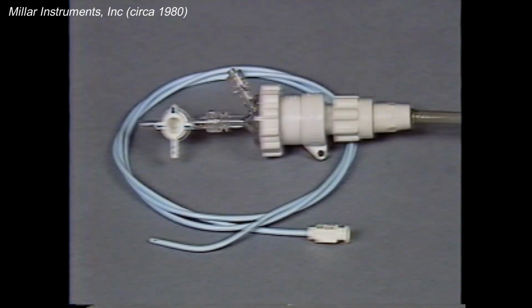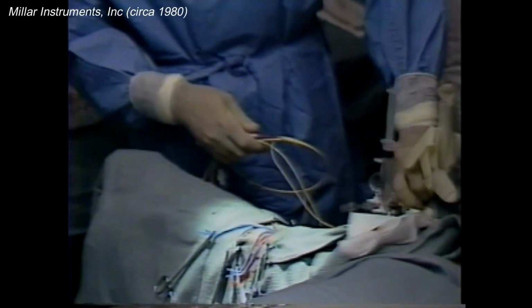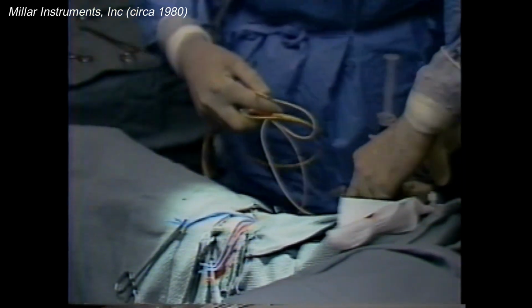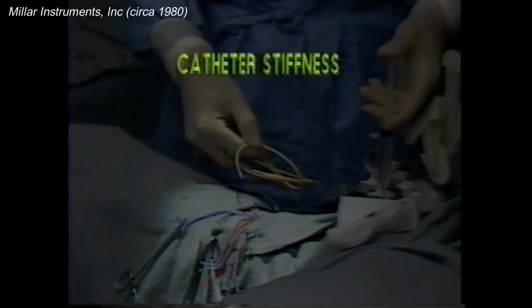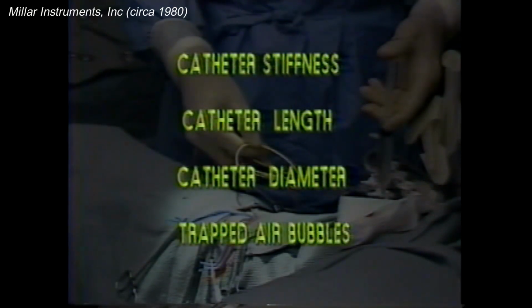Therefore, to understand this difference, we should first review those factors which affect fluid-filled catheters and their frequency response. The fluid in the catheter, because of its length and weight, limits the frequency response of the external transducer system. Four major interrelated factors that control the amount of distortion are catheter stiffness, catheter length, catheter diameter, and trapped air bubbles.